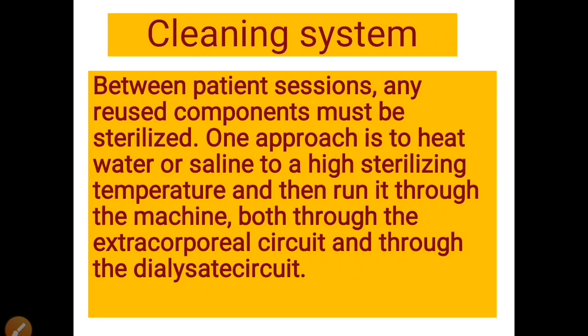A perfect dialysis cleaning system is very important. Hot water or saline can be helpful in this process. Hot water or saline needs to be at a high sterilizing temperature and then run through the machine.